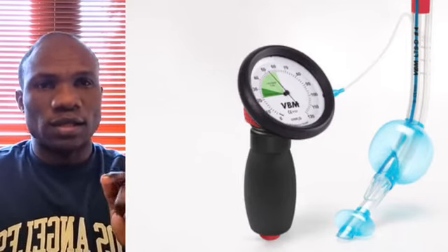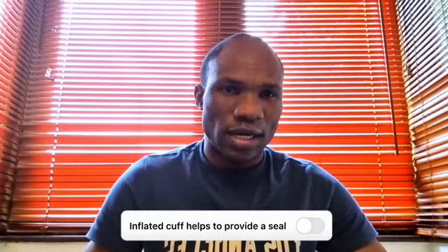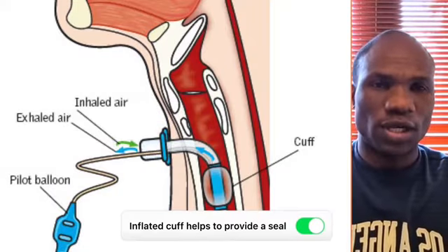So when you pass the tube into the patient, because it's invasive, it goes into the trachea of the patient, and then patients can get some air to breathe. It's important that the cuff is inflated after the tube is passed to the patient. The reason is that the inflated cuff helps to provide a seal between the tube and the walls of the trachea.